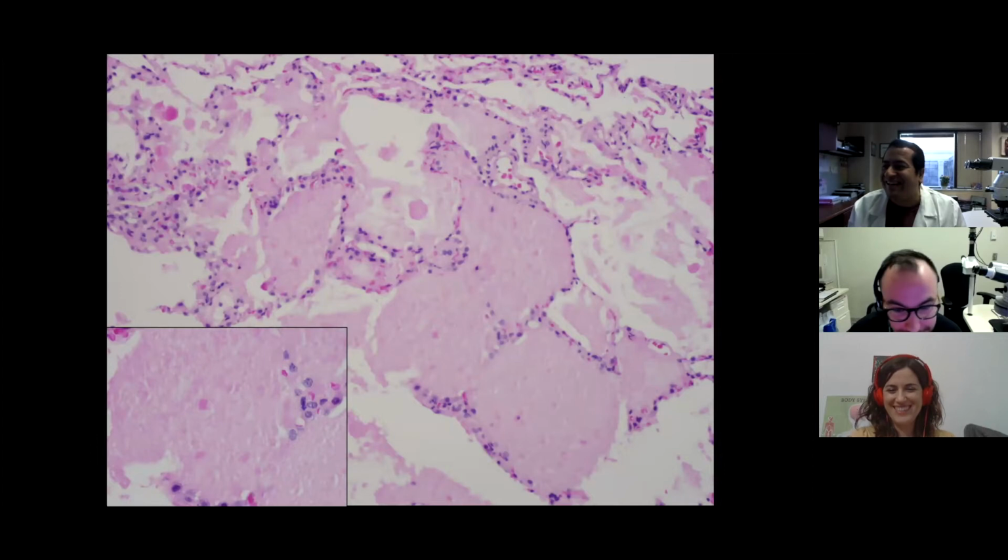Moving back to H&E. We're off the cytology, guys. All right. So this patient is a 29-year-old. Oh, well, let's make it 45-year-old.